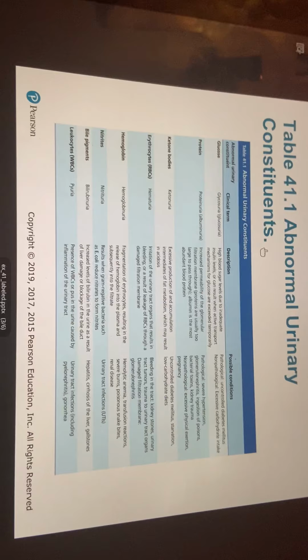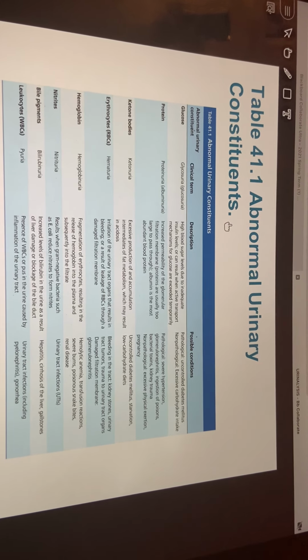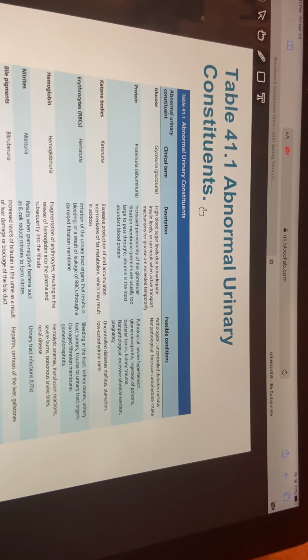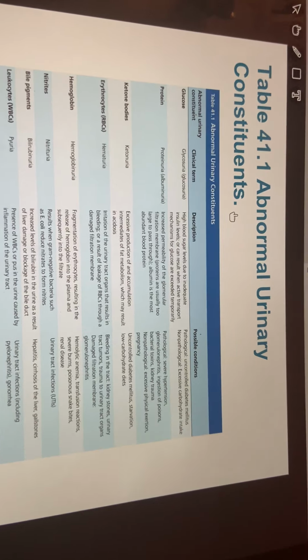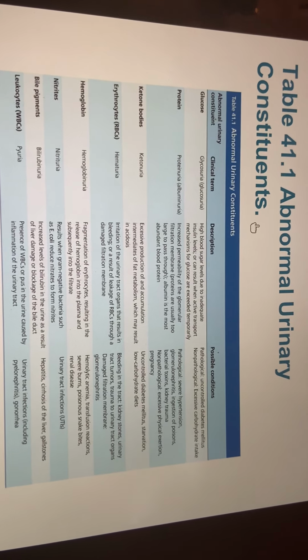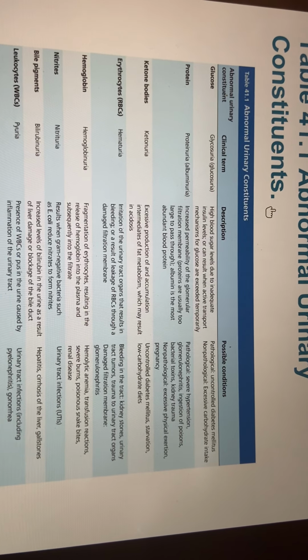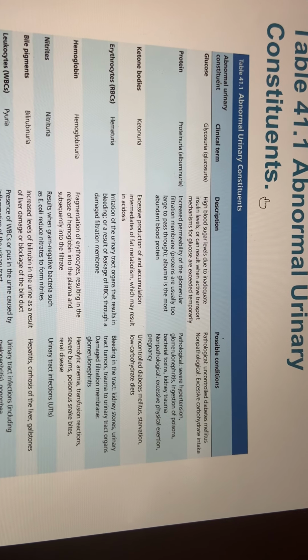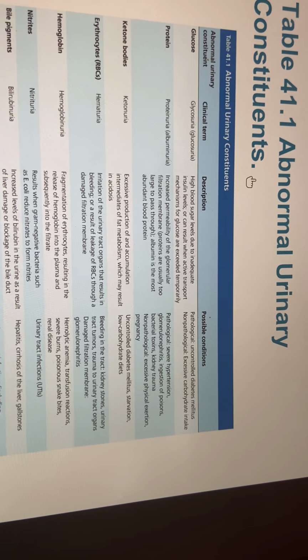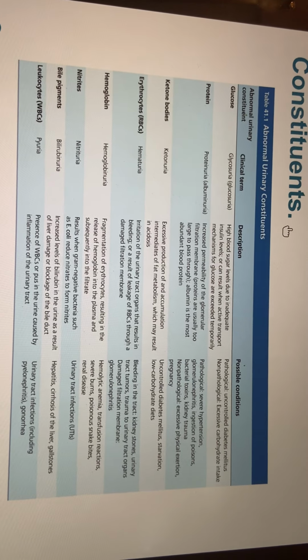Specimen. Unknown number one is diabetes mellitus. Okay? It's not unknown anymore. So just to give you an exercise, let's say pathologic specimen number one is diabetes urine, the urine of a diabetic patient. So you just put there diabetes mellitus, okay?